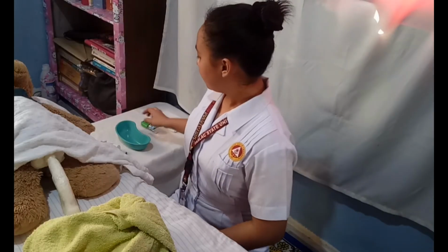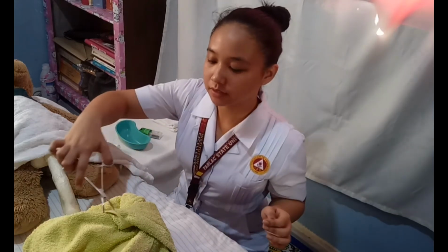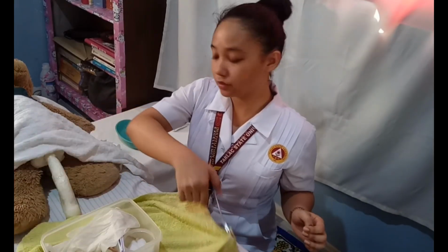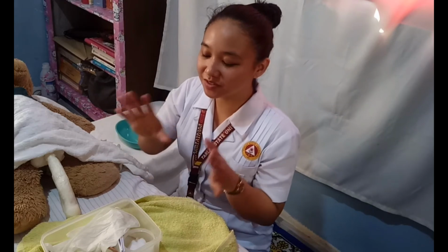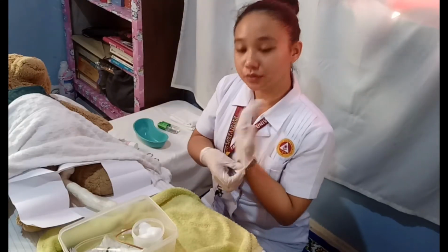And now for the male, same procedure, you need to hand wash. First thing you need to do is open the sterile catheterization set. Then, first, you need to put on the sterile gloves. So let's say, for instance, these are the sterile gloves.